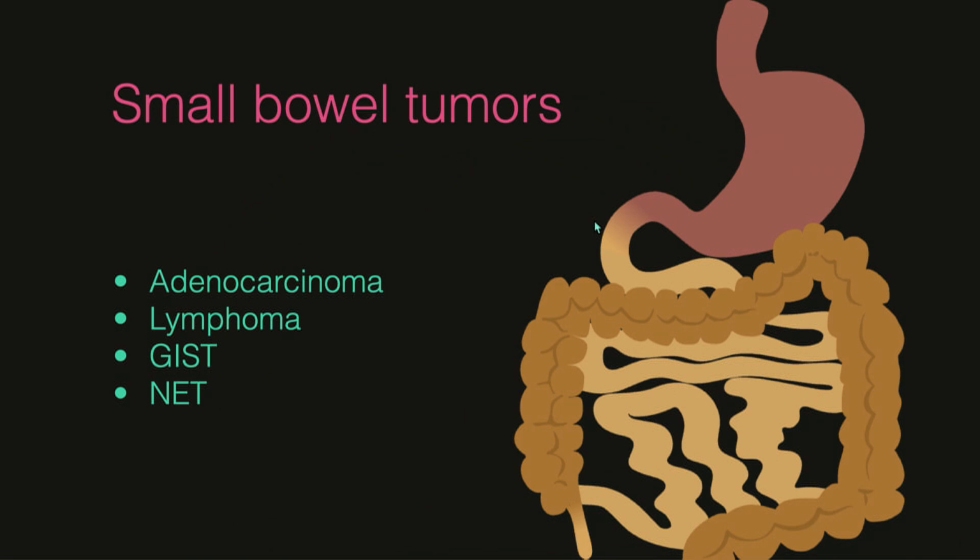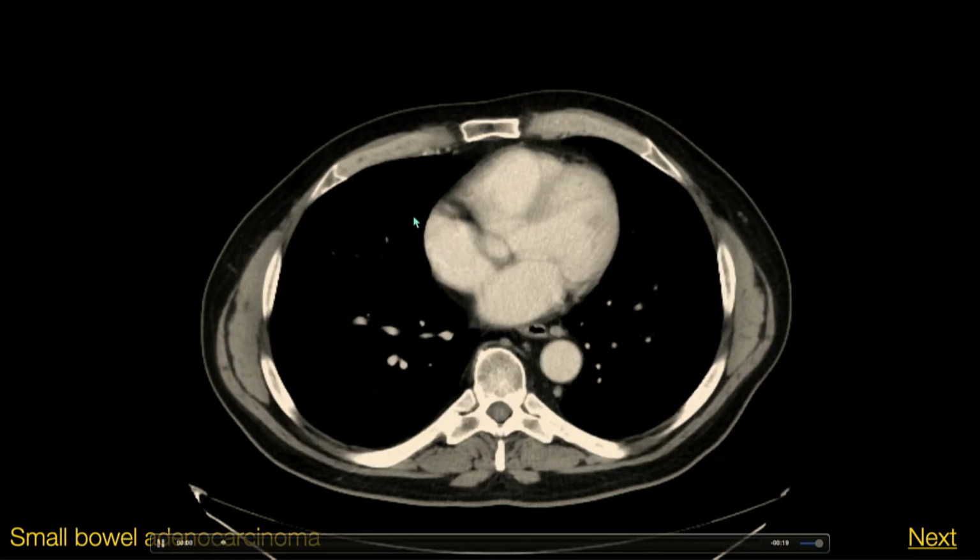Oops, okay, sorry, I'm going to go back. So we'll talk about small bowel tumors. We're going to touch on adenocarcinoma, lymphoma, and neuroendocrine tumor.